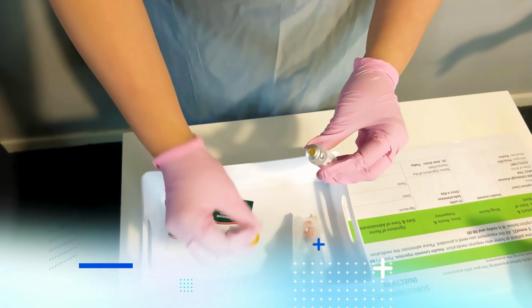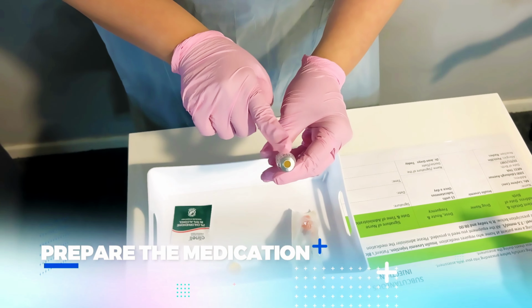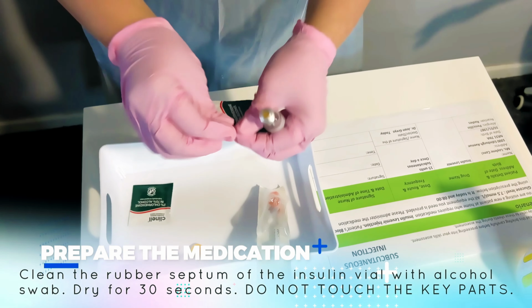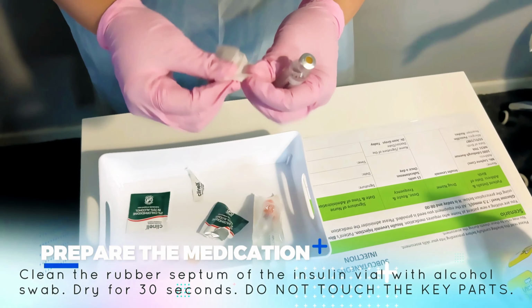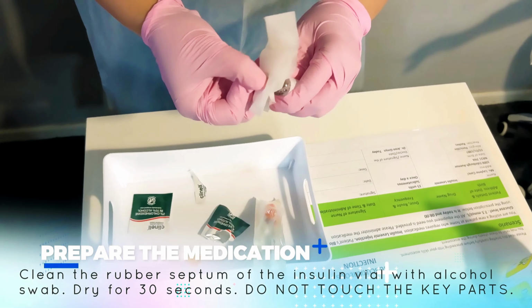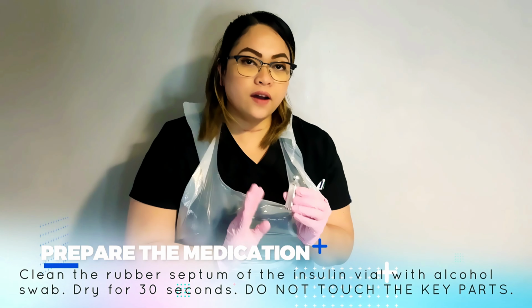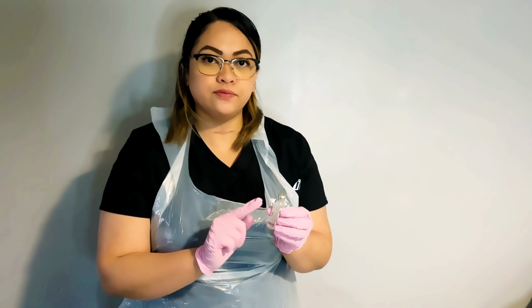So the first thing is to clean the rubber septum of the vial using alcohol wipe and dry it for 30 seconds. So after cleaning the rubber septum, I just need to wait for 30 seconds for it to dry.